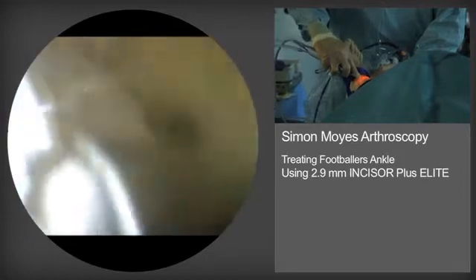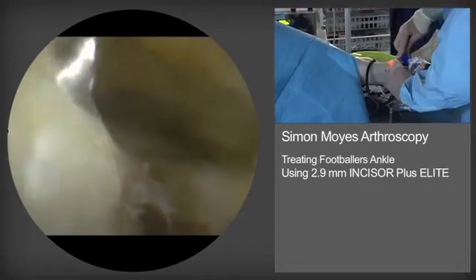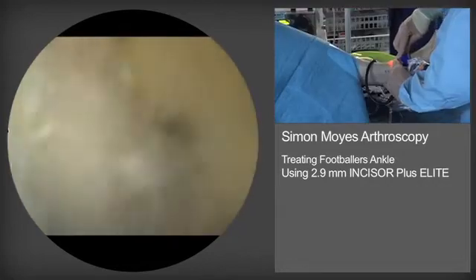Having resected the bulk of the anterior tibial spur, you can now see the usefulness of this oval burr to create a flat anterior surface.